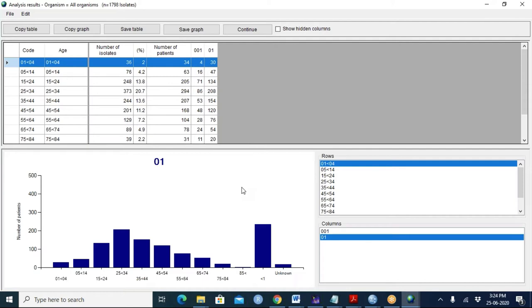Okay, so you see the value of this kind of demographic view? And you do have a lot of babies, is that correct? Yeah, that's true. Basically, one of the reasons we're doing this is for epidemiology. That's a good second reason. The first reason is quality control. Does this make sense to you? If it doesn't make sense to you, there's probably a mistake.